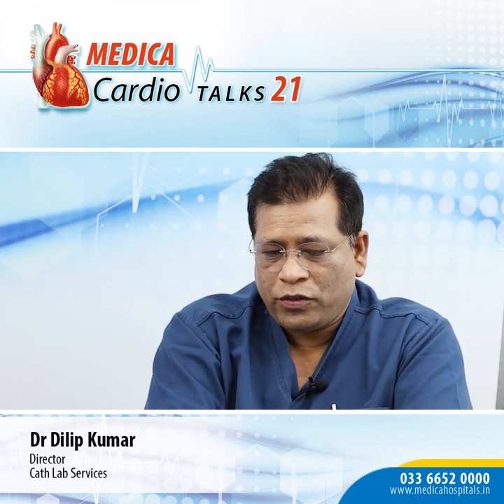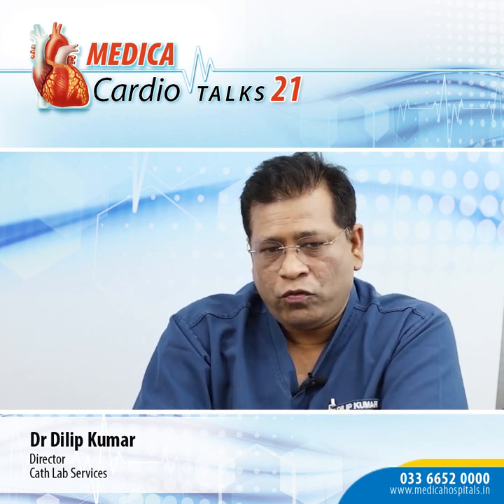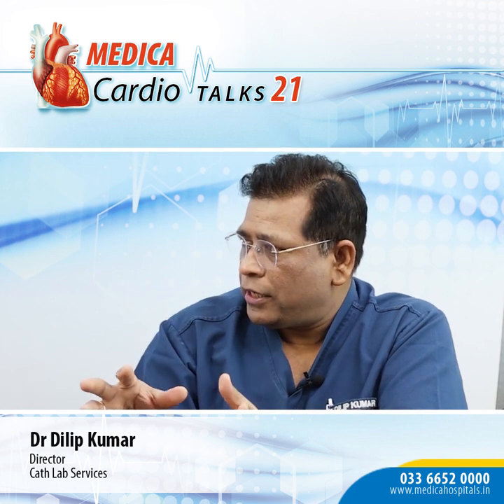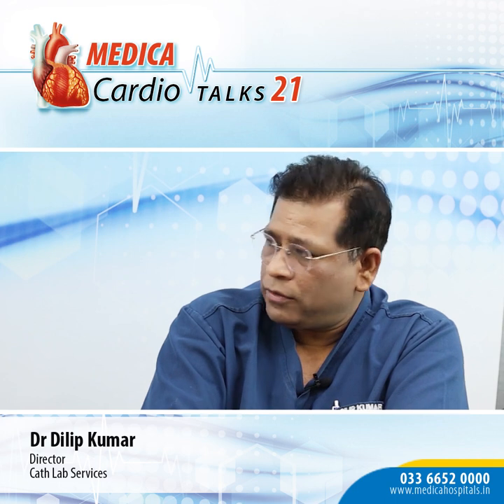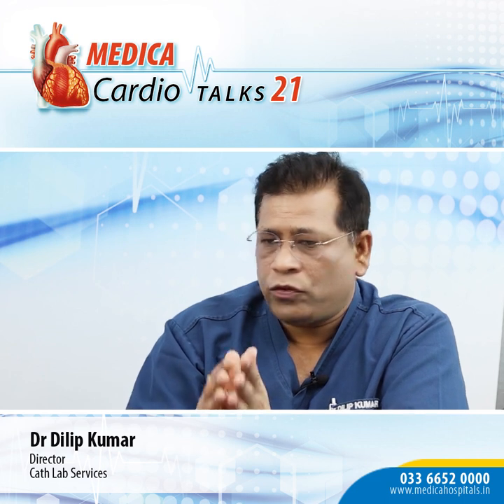What are your thoughts about the future of transcatheter tricuspid repair for the interventional cardiologist? What would be your take-home message for our audience? The final summary: the surgical threshold for repair of tricuspid valves during left-sided surgery should be very low, and the guidelines should be adopted and adhered to. Number one, it should not be left out. Second, for all surgically turned-down patients or high surgical risk patients with favorable anatomy for tricuspid valve edge-to-edge repair, we should go for TEER as the first option.